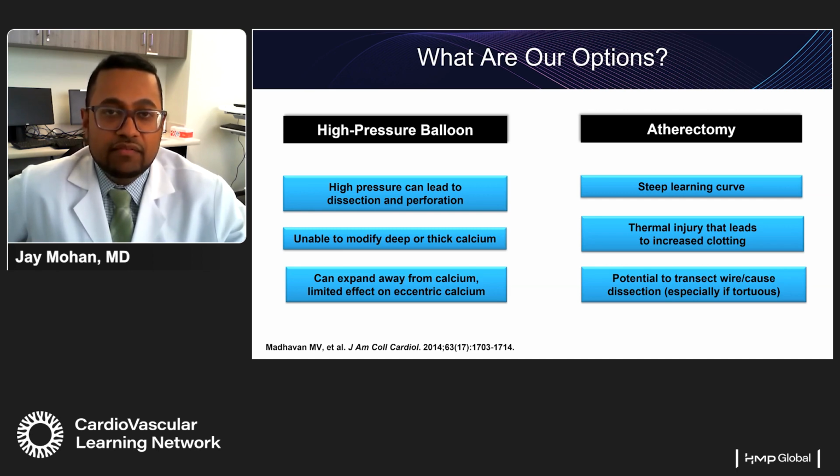But we realized that you were solving one problem. You were fixing the stenosis, but you really weren't changing anything with the vessel compliance, and you weren't changing how calcified the vessel was. You just made the lumen a little bit bigger.